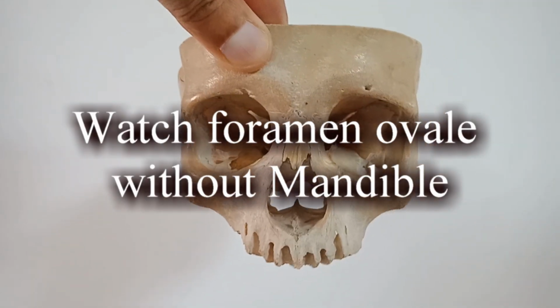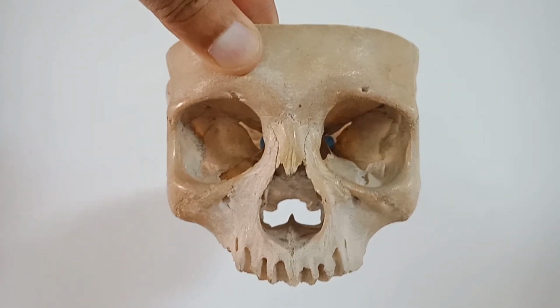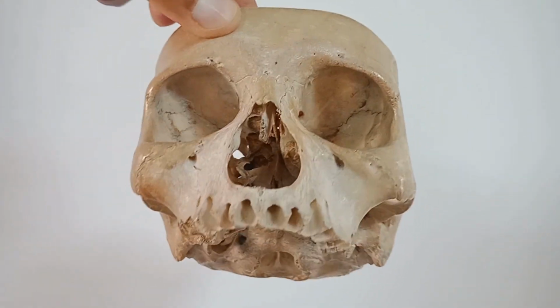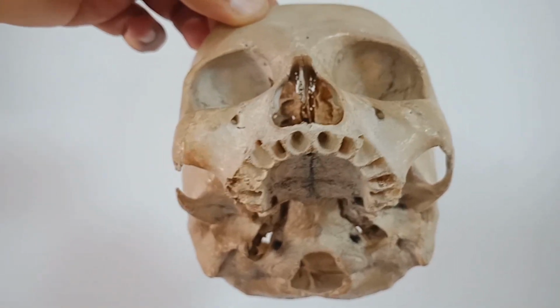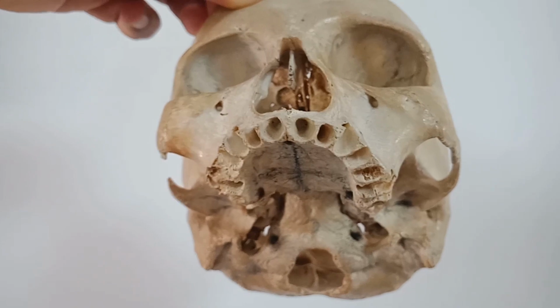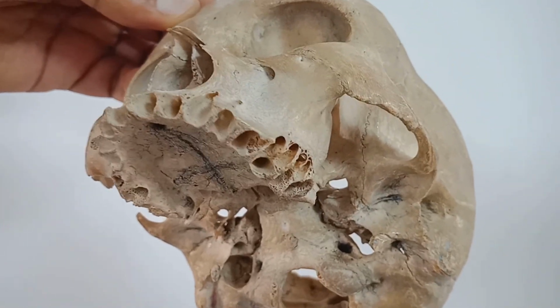See, when you are watching in AP view, you cannot see the foramen ovale. For that, you have to first extend the neck. So that is what we are calling submental. And now come a little oblique. You can see the foramen ovale clearly.